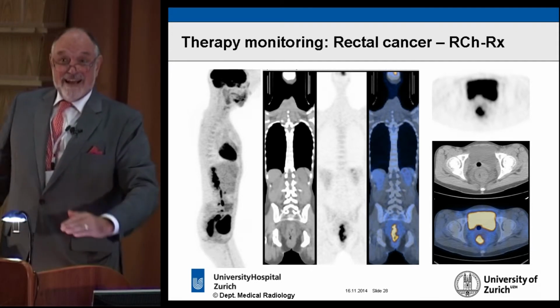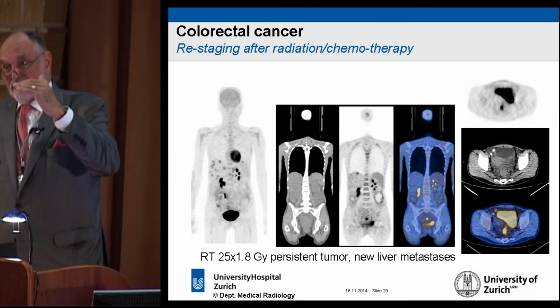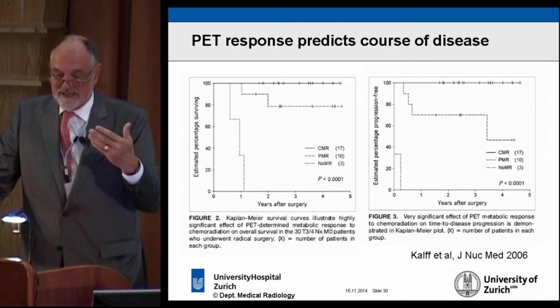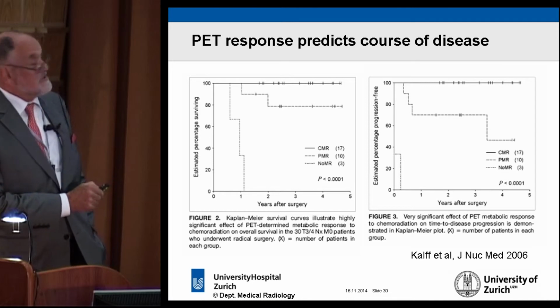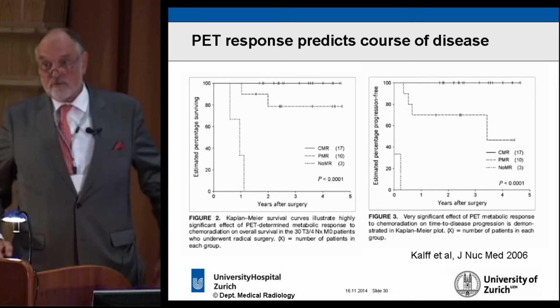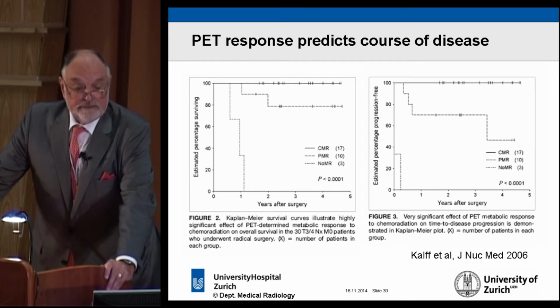And in fact, in all tumors, when you draw these Kaplan-Meier plots and you stratify patients who after therapy showed a decrease or complete lack of FDG versus those who maintained FDG uptake in the lesion, it has a very, very heavy prognostic implication. So these patients responded by FDG. FDG was negative in these patients. You can see those who have persistent FDG uptake, they die very quickly. So FDG is a very good marker of malignancy and is an outcome stratifier.